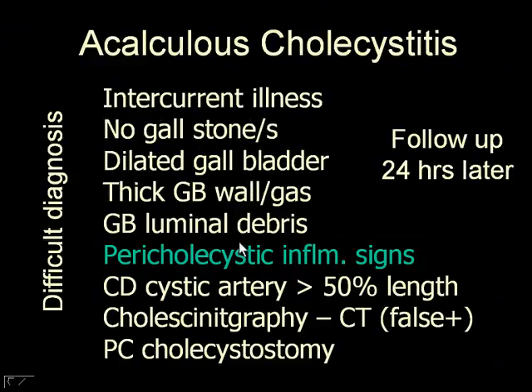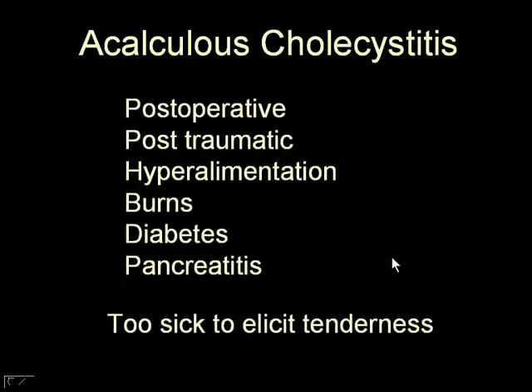They could be aged, they could be postoperative, they could have intercurrent illnesses. There are no gallstones there, the gallbladder is dilated, but what is very important is that there are pericholecystic inflammatory changes. To me, this helps me to say that yes, this gallbladder is the culprit. Although there are no stones, there is pericholecystic inflammation, and let us see how this looks.